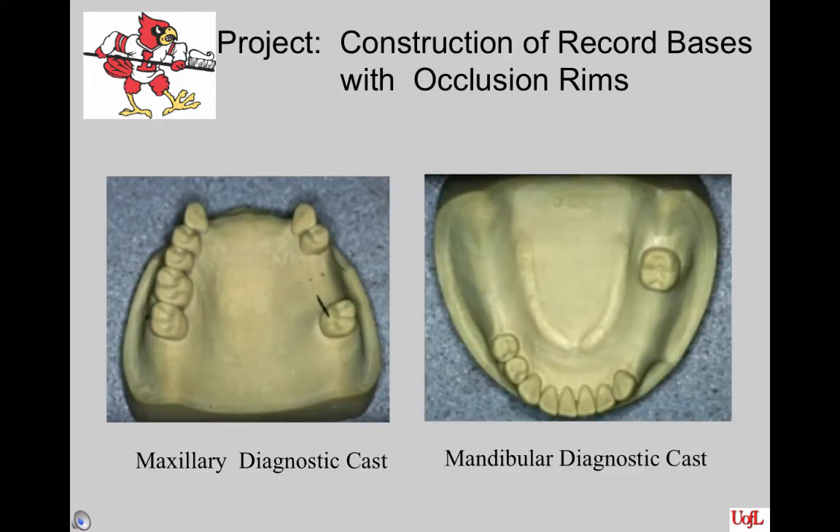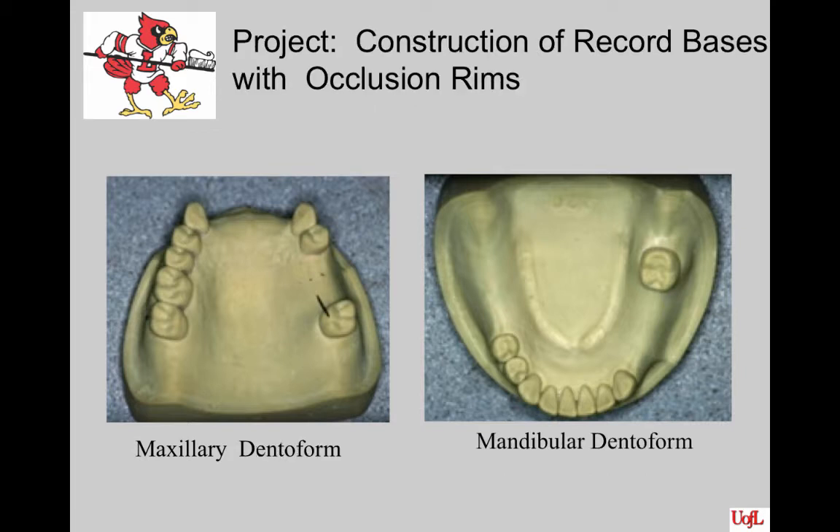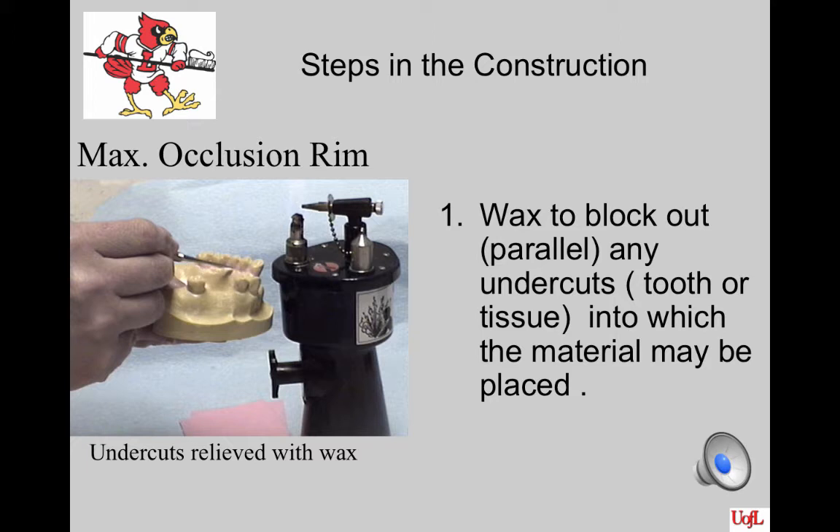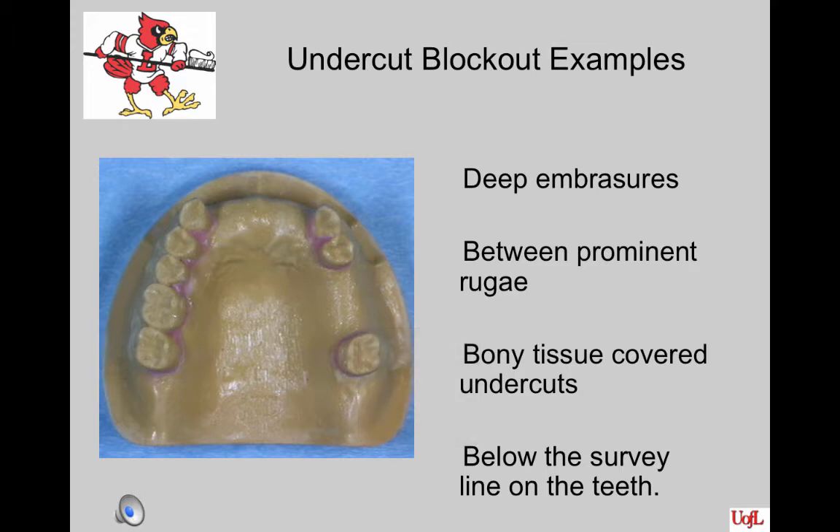What you need to work on for this project is your diagnostic cast made from your two denteforms. Before you begin, ideally you will survey the cast so that you can see the undercuts and then place the design of the record base on the cast. There are no rules other than that you want this base plate to be stable and you don't want it to move anteriorly, posteriorly, or laterally when making a jaw registration. Use base plate wax to block out parallel any undercuts — tooth or tissue — into which the material may be placed. Examples are deep embrasures, prominent rugae, bony tissue covered undercuts, and below the survey line on the teeth. Do not go above the survey line with your block out wax.